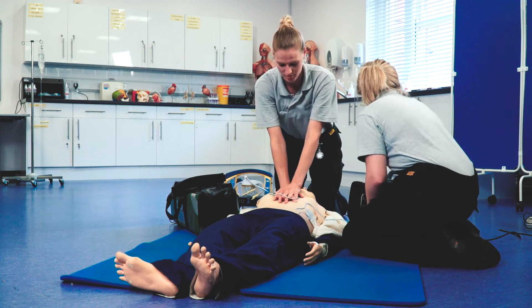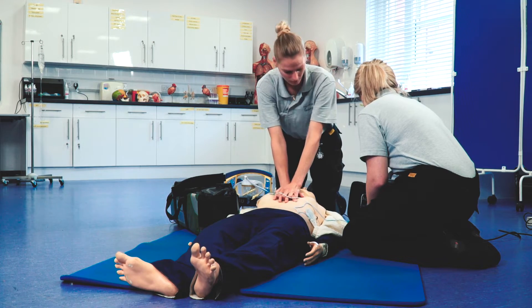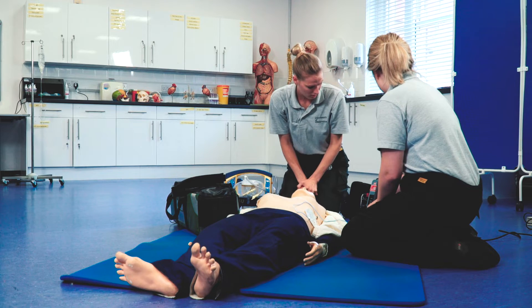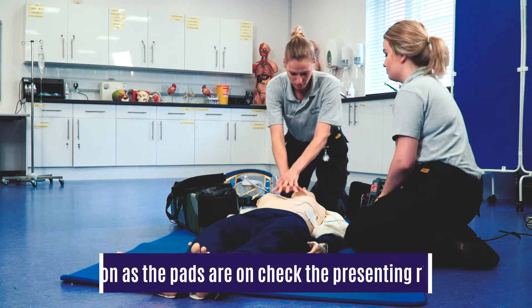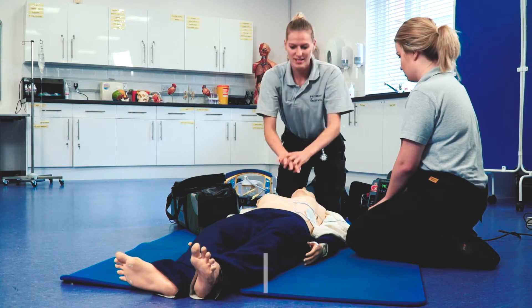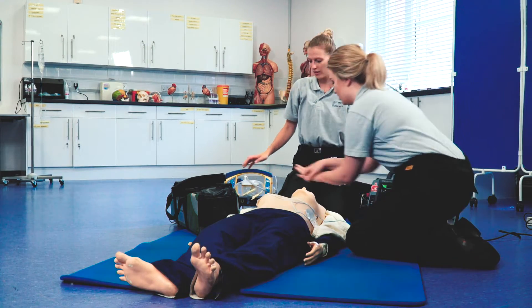We need to do a rhythm check. So the patient is in VF — a shockable rhythm — so I'm going to charge. After this shot, can you take over please? Ventilate. Stand clear. Shocking. Compressions please.